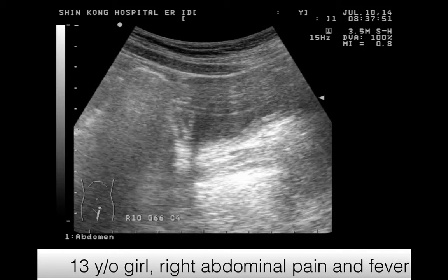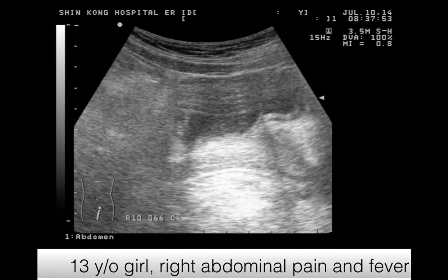It's difficult to identify at the first encounter because I have not seen that before. So I scan a lot and try to figure out what's going on and to see the outpouching, right? To find the pattern, but at the first encounter, I cannot name the abnormality. I don't have much experience, so I recognize the patterns and try to find out what's going on. So we will arrange the CT scan because that's kind of a problem. It is unique and has some problem.